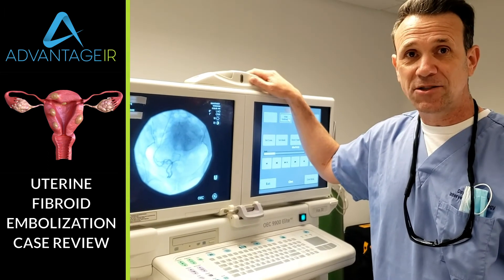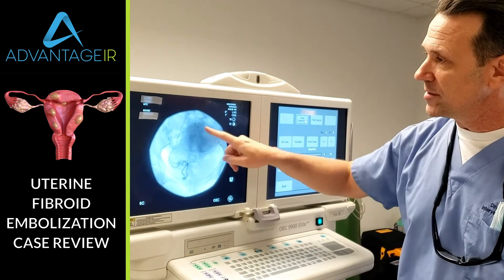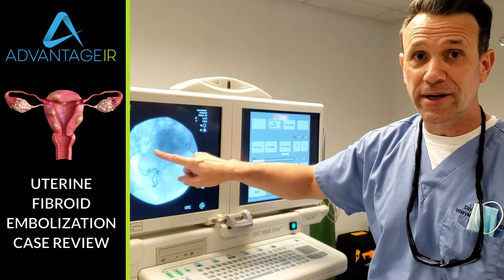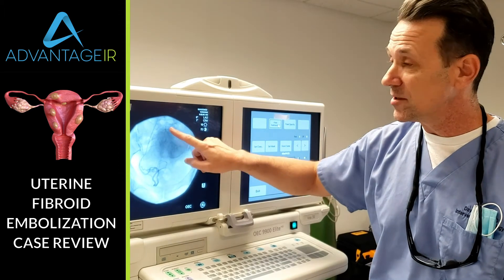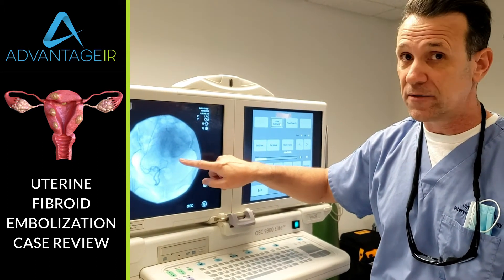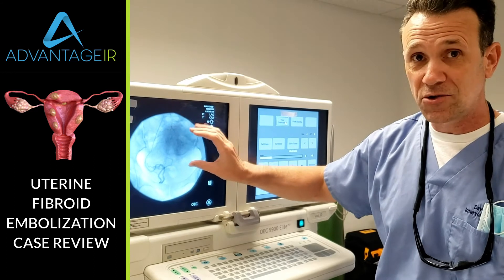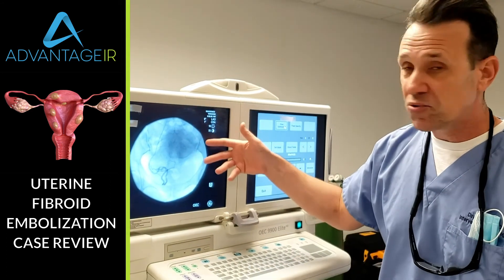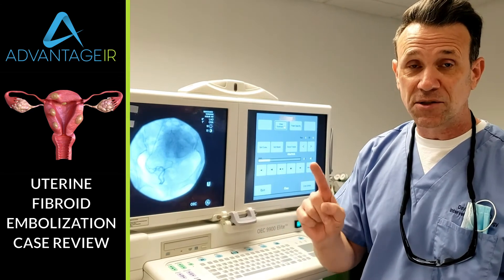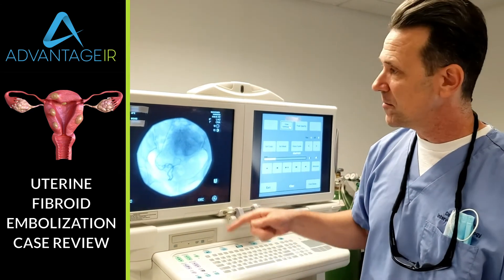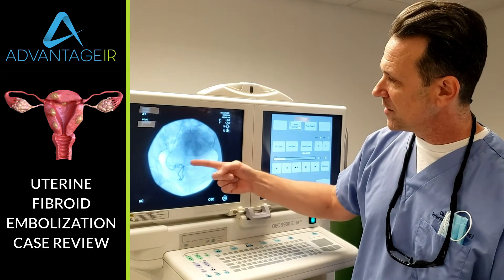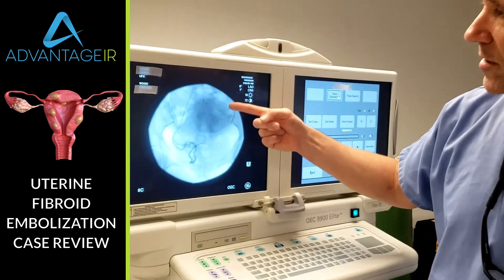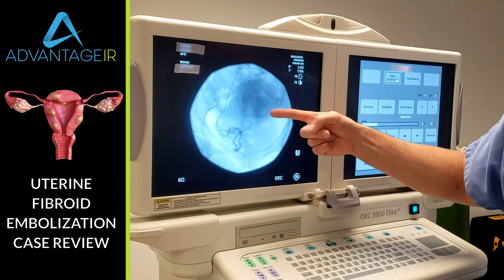As we are getting the angiogram of that right uterine artery, you can see contrast sitting in the capillaries of the fibroid we already treated. That's contrast just sitting in the fibroid because we've stopped the blood flow — the contrast is no longer getting washed out by new blood coming in. This is proof not only that we stopped the blood flow and successfully treated that fibroid, but it also gives us a view of the fibroid that we wouldn't usually have. You can see this dark staining of that first fibroid that we treated here.